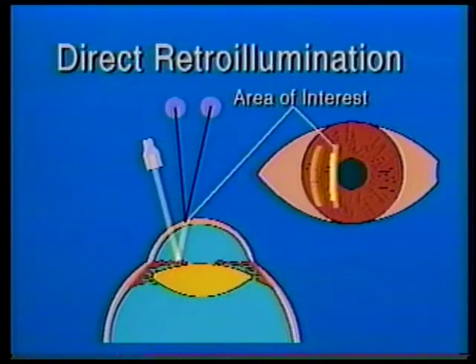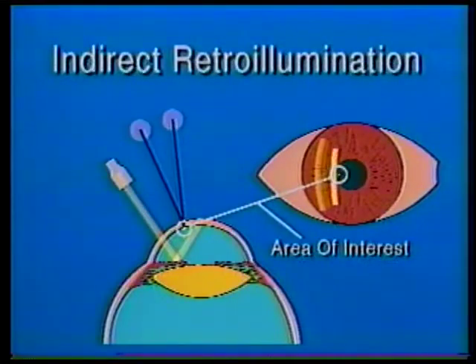Four, retroillumination produces two types of illumination. First, direct retroillumination, which reveals details in the reflected light, such as this small corneal foreign body rust ring. And secondly, indirect retroillumination, which reveals the details just off the path of the reflected light, as shown by this Krueckenberg pigment spindle on the corneal endothelium.